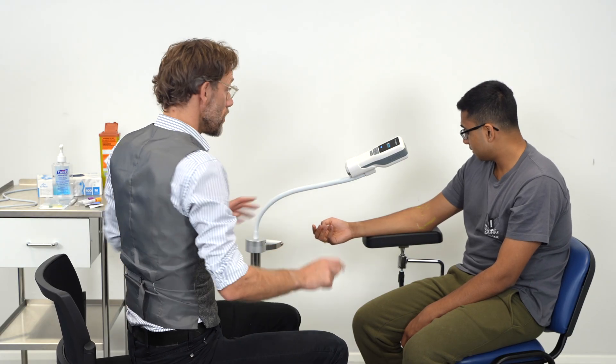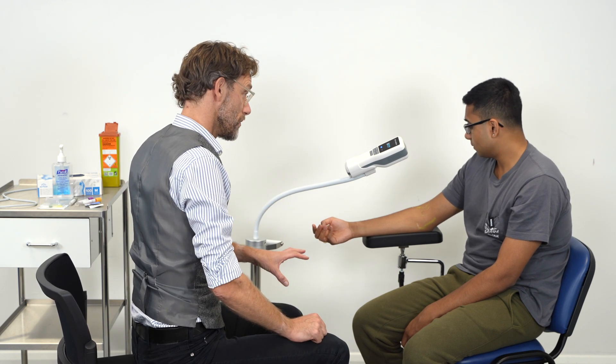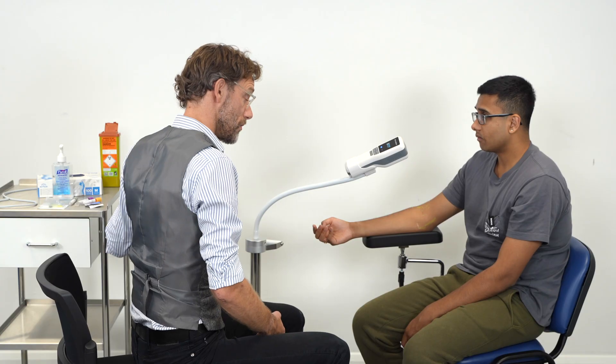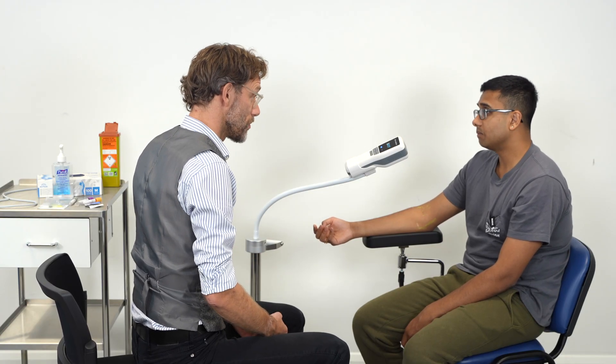Yeah, absolutely. So are you right or left-handed? I'm left-handed. Okay. So what I'll do is put the tourniquet on, and that will let the vein swell up, which we'll see on the machine. And then we'll wipe the area with alcohol, and then we'll take the blood. Hopefully we shouldn't have any problems.